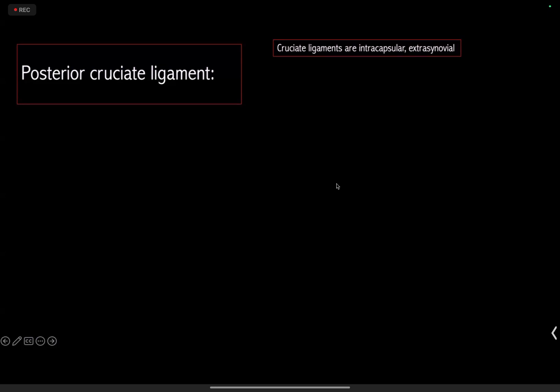Yes, because there would be an increase in the bulk of the ligament, so the functional viability of the ligament is partly compromised. I would not say that it would be completely hampering the movement, but it would be restricted movements. Yes, sir. We do mucoid ACL injections, ultrasound guided, for restricted flexion, and that really helps them, especially if there's a ganglion at the femorotibial attachment. So they do cause restriction of movement, especially terminal flexion is restricted.